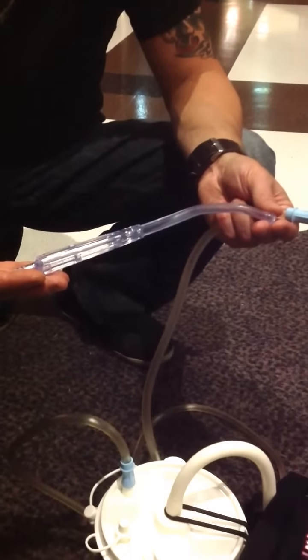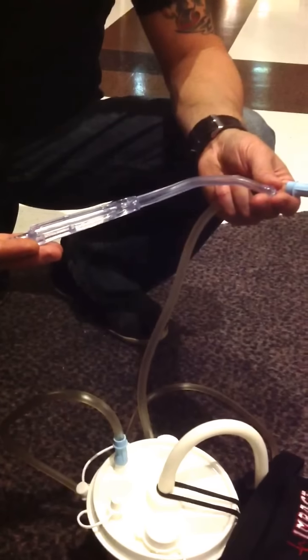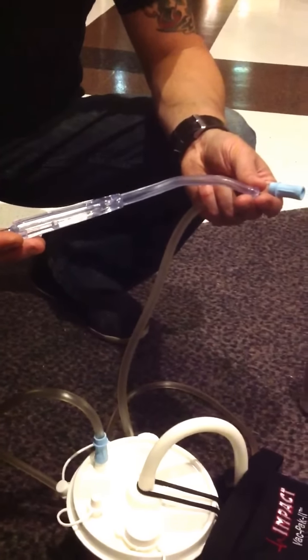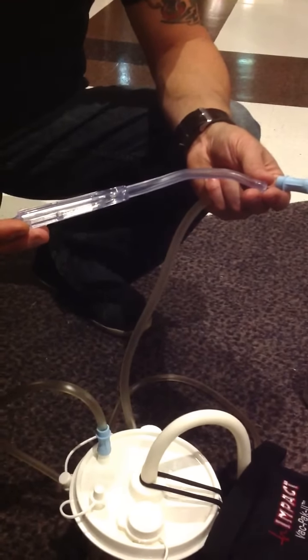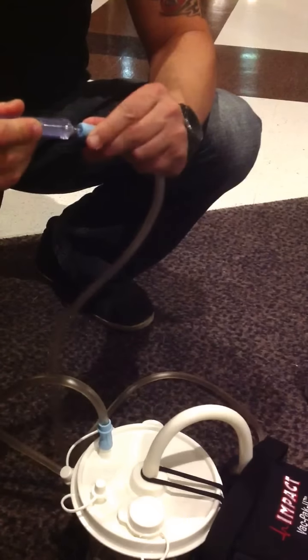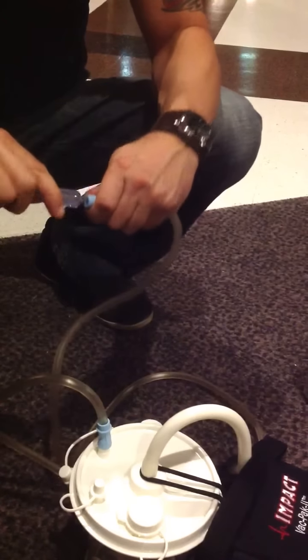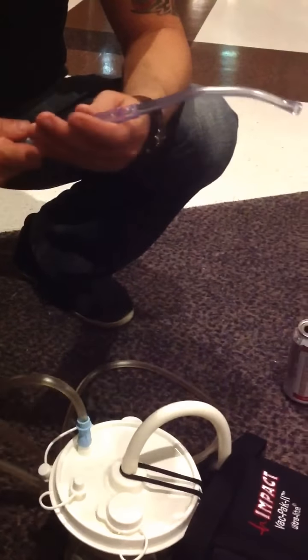The most commonly used one is the rigid tip, also called a Yankauer tip or a tonsil tip, although a suction catheter is another option. It's softer, and it's used often in stomas and for breathing tubes. In cases where large chunks of material are being removed, it might even be better to avoid the tip altogether and just use the tubing, because the opening is normally a little bit wider.